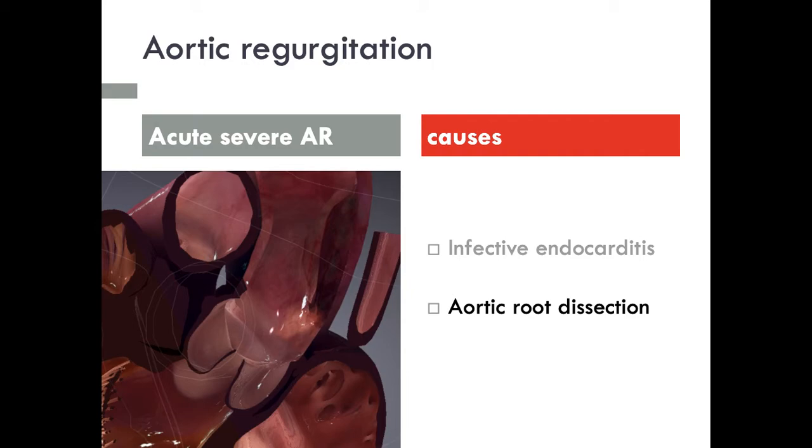Just a little bit closer up. And on the ultrasound image, we see this flap as an extremely mobile linear structure in the aorta.